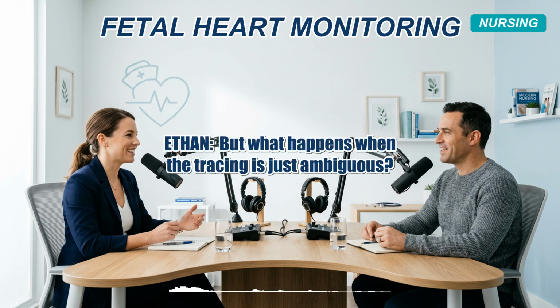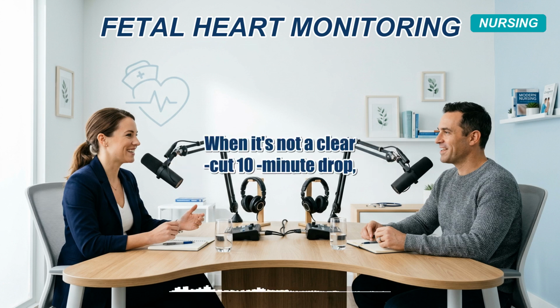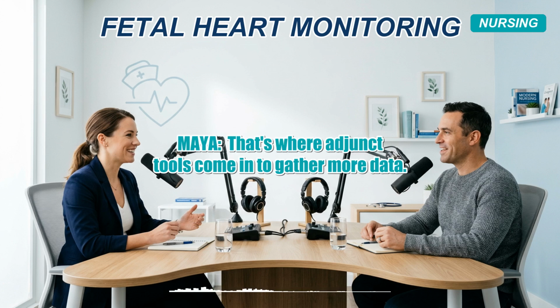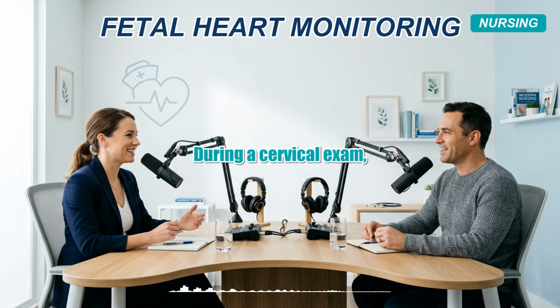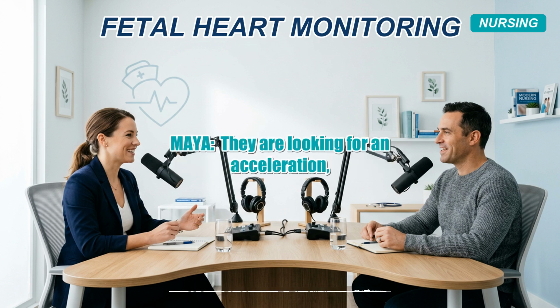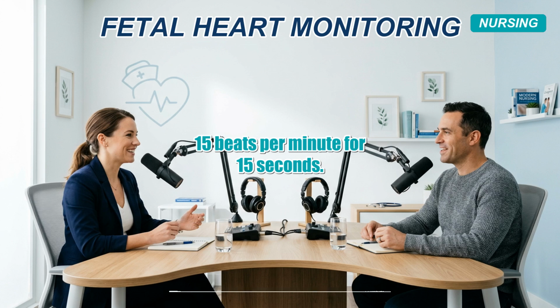But what happens when the tracing is just ambiguous? When it's not a clear-cut 10-minute drop, but it's not totally reassuring either? How does a doctor decide what to do? That's where adjunct tools come in to gather more data. One method is fetal scalp stimulation. During a cervical exam, a clinician will gently rub or stimulate the baby's scalp. Okay, why? They are looking for an acceleration, a reassuring rise in the heart rate of at least 15 beats per minute for 15 seconds.